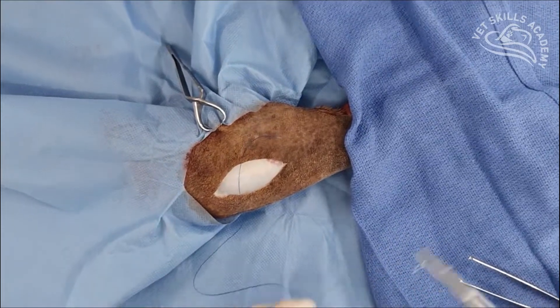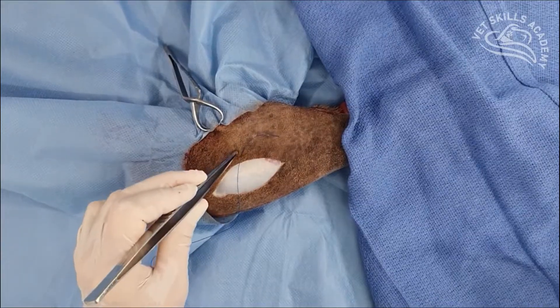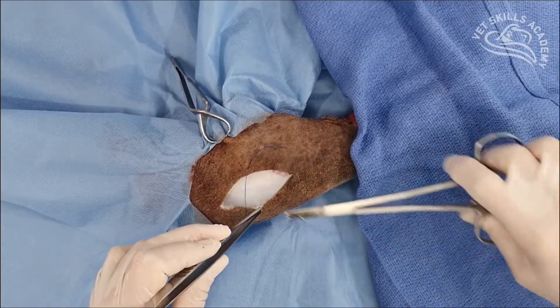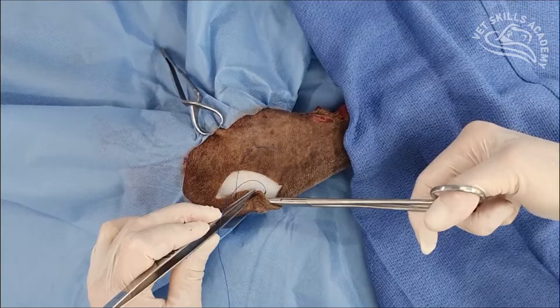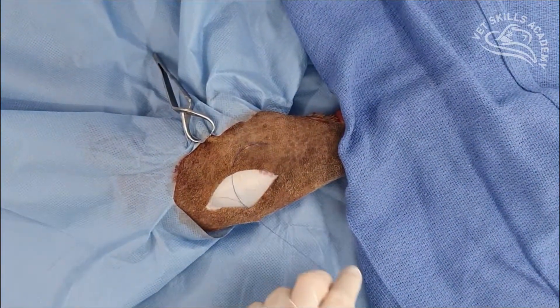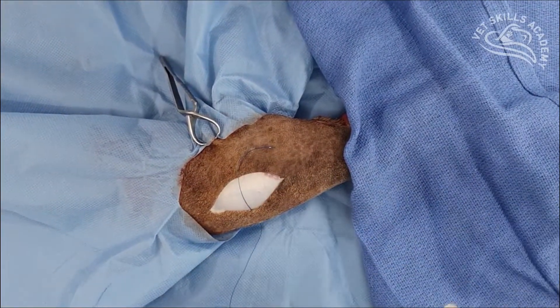Our next bite is going to be the far component. So we come straight across, perpendicular to our incision, and go right through the dermis. Take a decent far bite. So here we are taking the far bite. So that's the near, and that's the far.